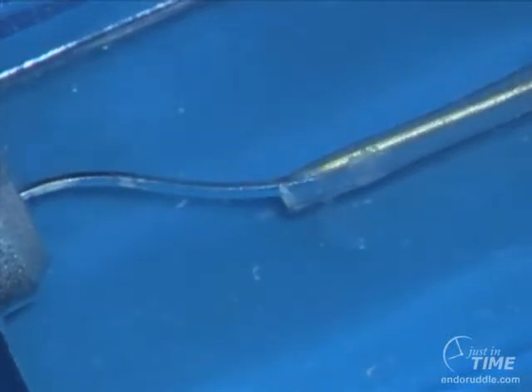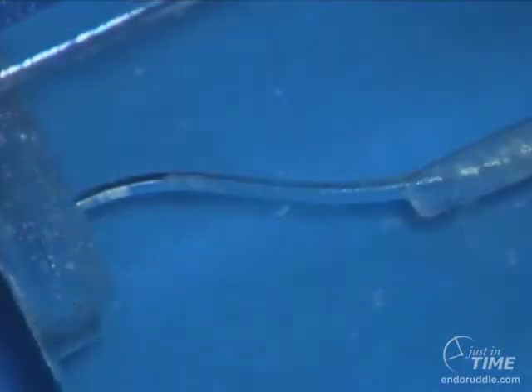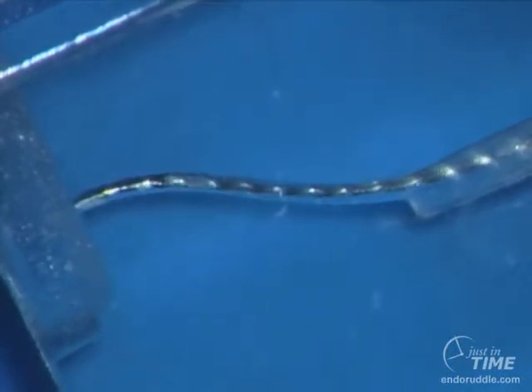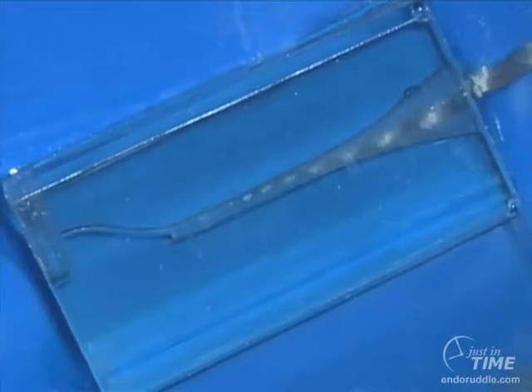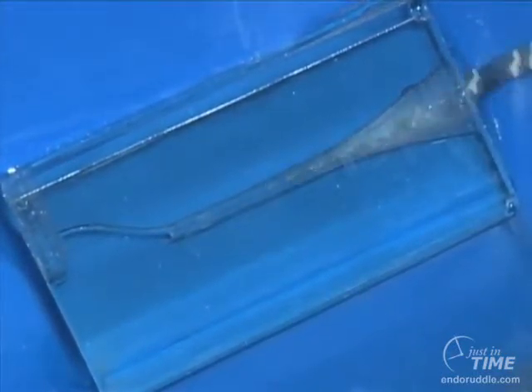This ledge could be iatrogenic in etiology, or it could be actually pathologic, like in the instance of a resorptive defect. I'm working small-sized hand files that are pre-curved, carrying them through a pre-enlarged canal, and with some determination and desire and sufficient time, I can begin to work 10s and 15s apical to the impediment.